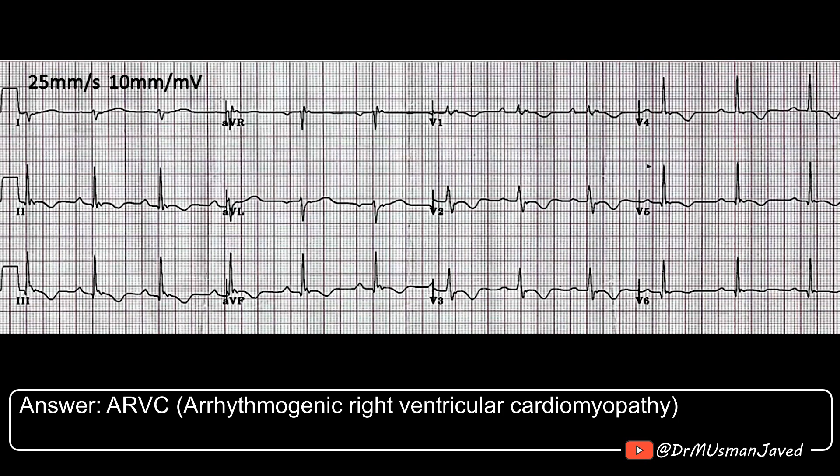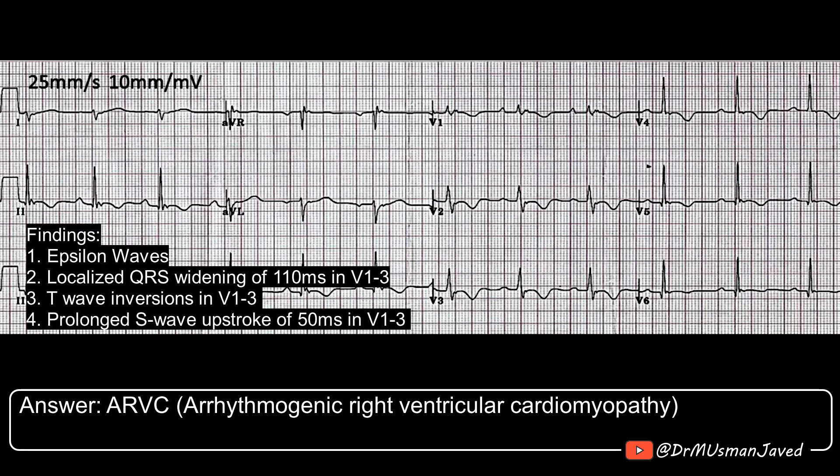This ECG is showing a normal sinus rhythm with upright P waves in the inferior leads. There is right axis deviation. An important finding is an epsilon wave — a little blip at the end of the QRS complex.